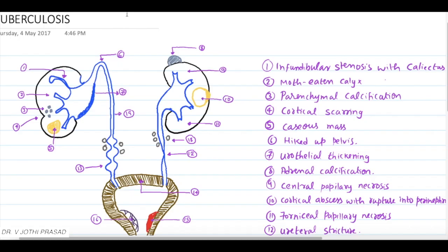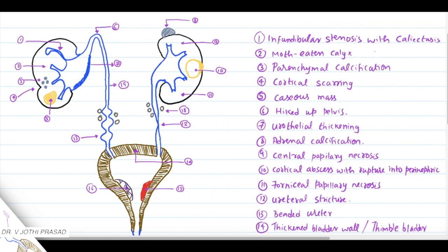This is an overview. Let's take a closer look. It's the same image with naming. The first finding is infundibular stenosis with caliectasis. As you can see here, I have depicted the infundibular stenosis with caliectasis - there is stenosis in the infundibulum with dilatation of the caliectasis.